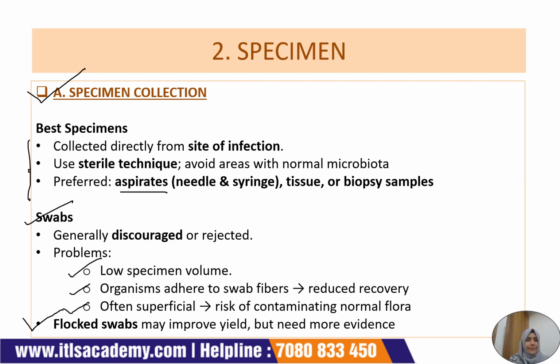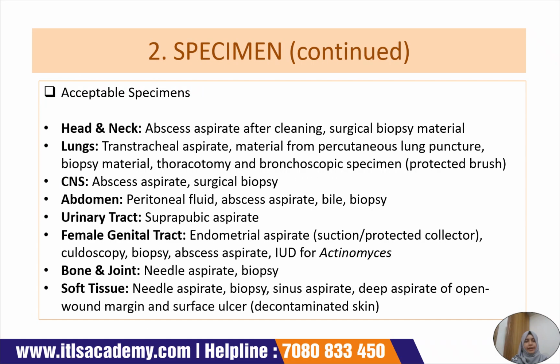Now, acceptable specimens. These are the acceptable specimens of anaerobes that are taken from these areas. Let's discuss in detail. From the area of head and neck, abscess aspirate is taken from surface sterilized or decontaminated areas and from surgical biopsy materials.